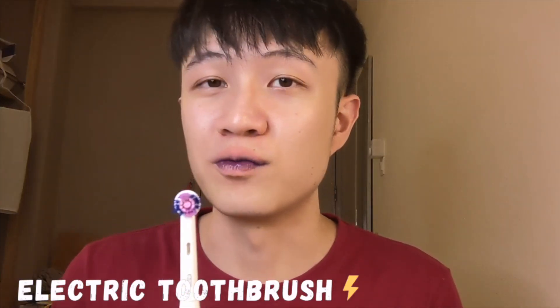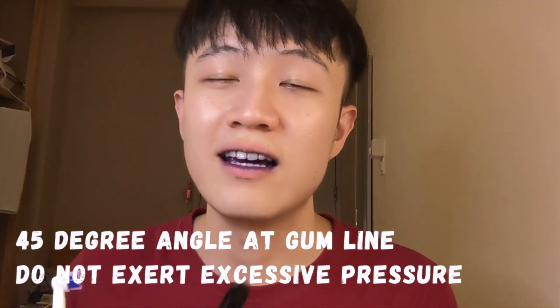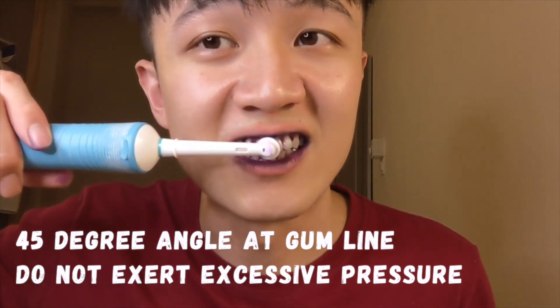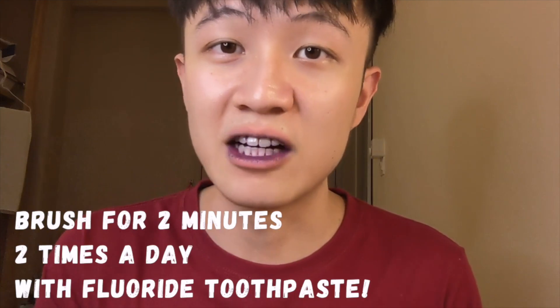Let's have a look at the before results. The areas that are purple are basically areas with plaque, and our objective would be to remove plaque from those areas. Let's first start with the electric toothbrush. To use an electric toothbrush, you just have to angle it at a 45-degree angle towards the gum line to ensure that you're cleaning the gum line, just like how you would use a normal toothbrush — slightly upwards at a 45-degree angle.